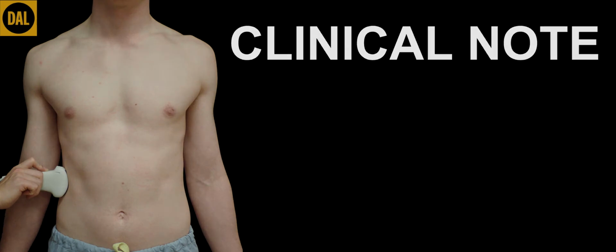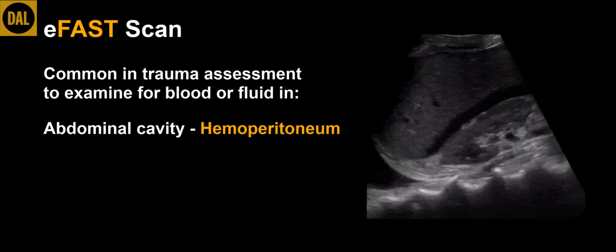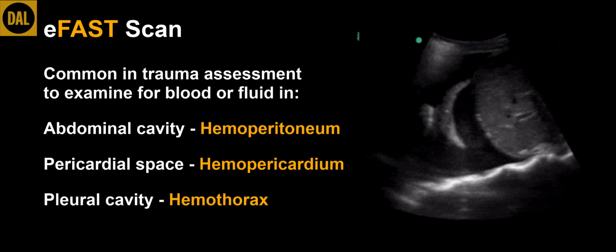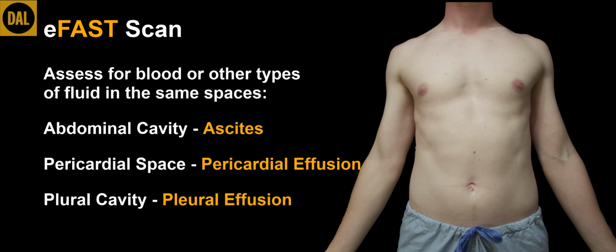Clinical note. This scan is most frequently performed in trauma, assessing for the presence of blood or other types of fluids in the abdominal cavity, hemoperitoneum, in the pericardial space, hemopericardium, or in the pleural cavity, hemothorax. This scan can also be used in non-traumatic patients, assessing for the presence of either blood or other types of fluids in these spaces.